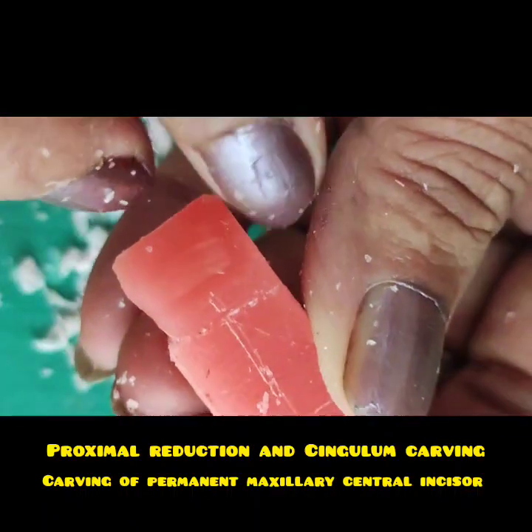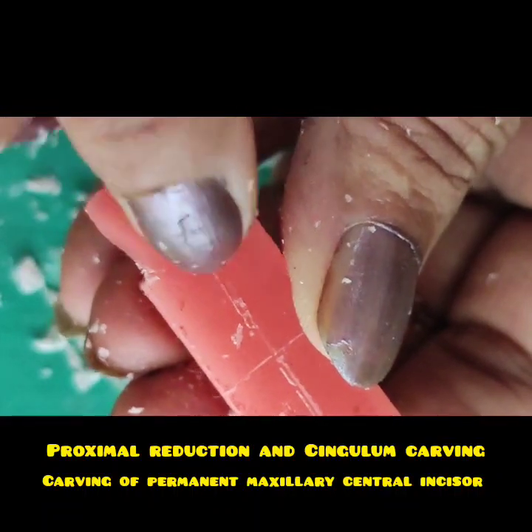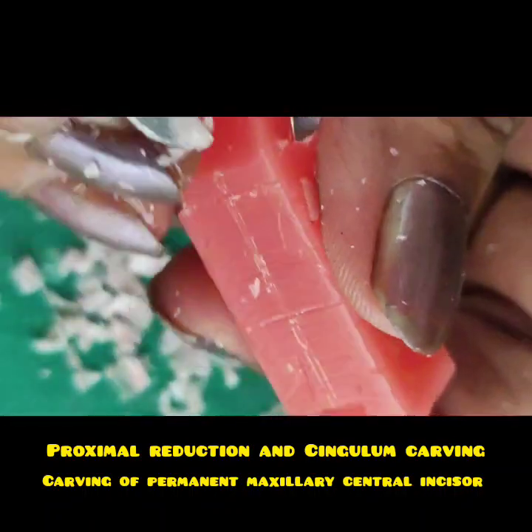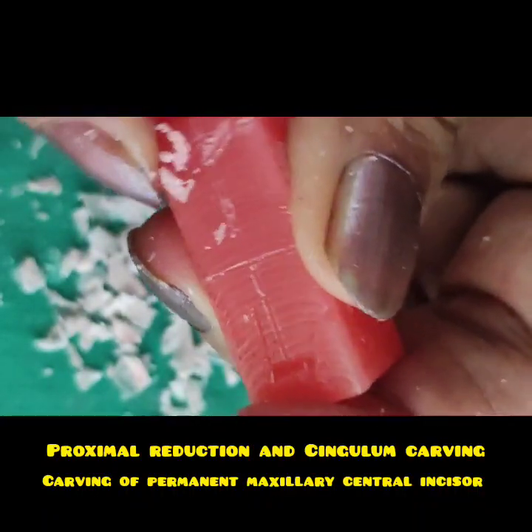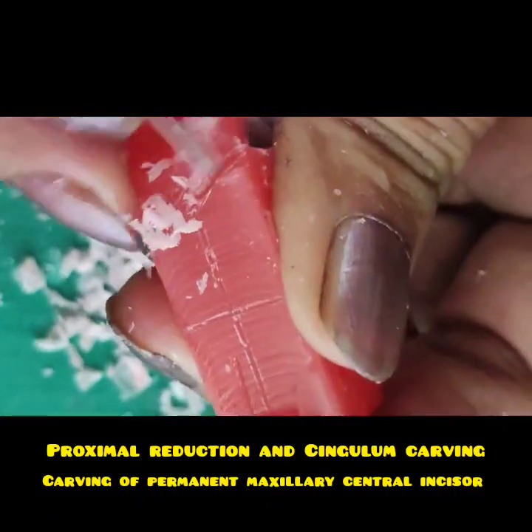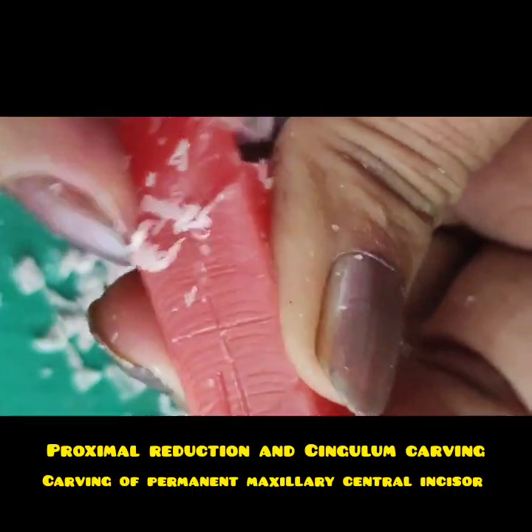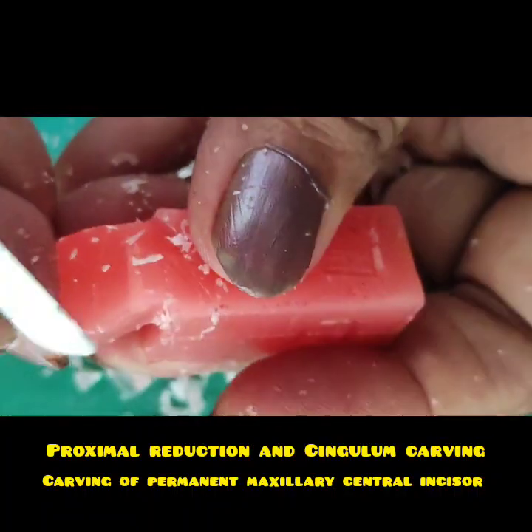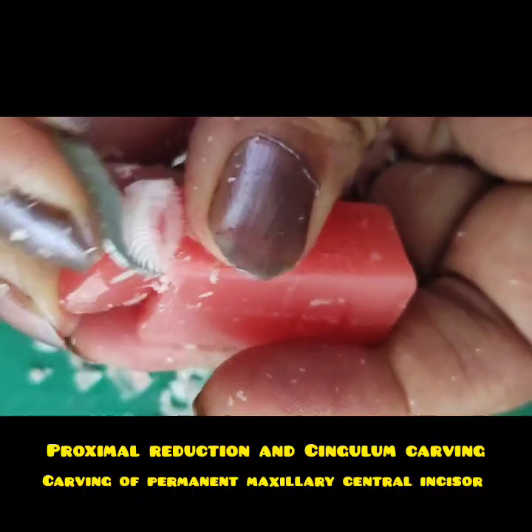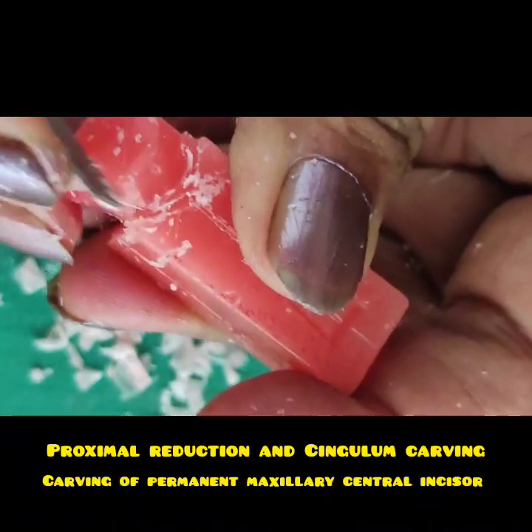Similarly, my labial surface also should converge cervically, and it should have a nice U shape as per dimension. So I will give proximal convergence like this from the opposite side also, and give a nice U shape.